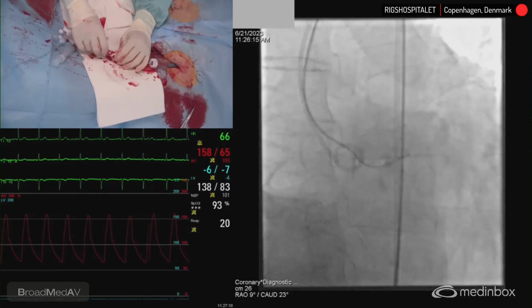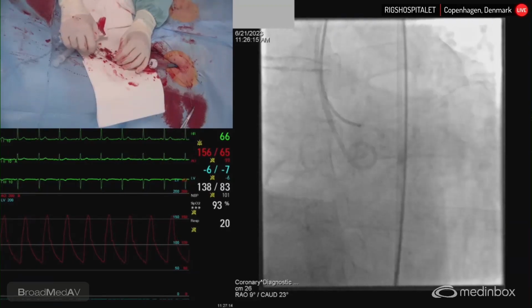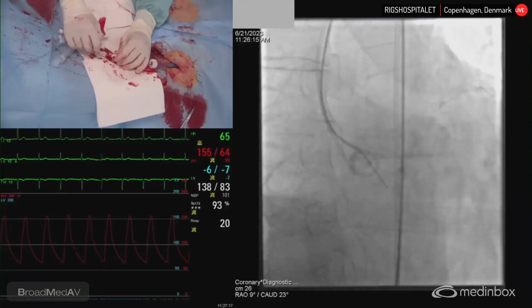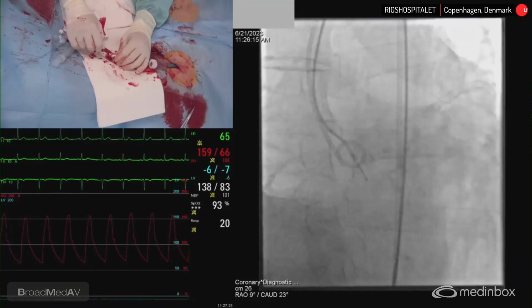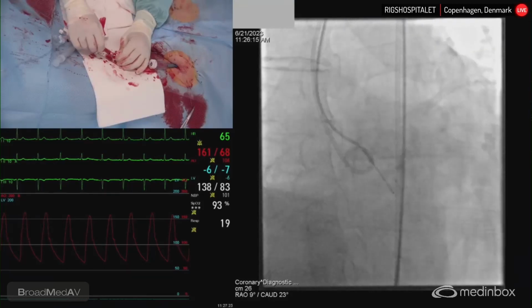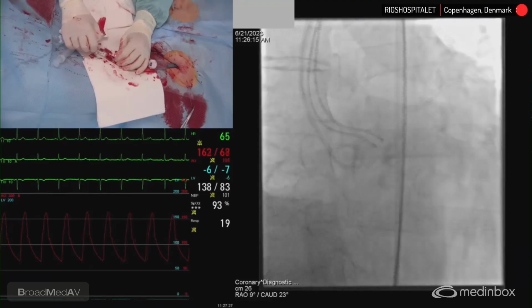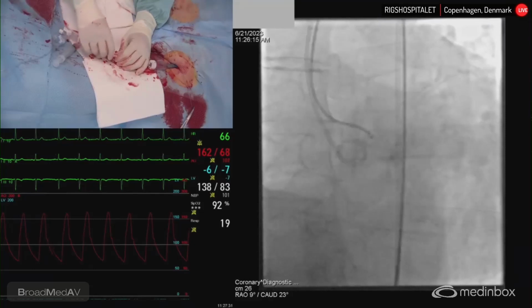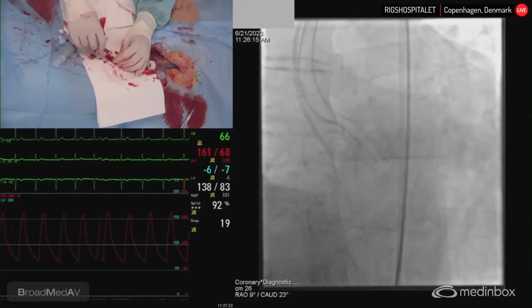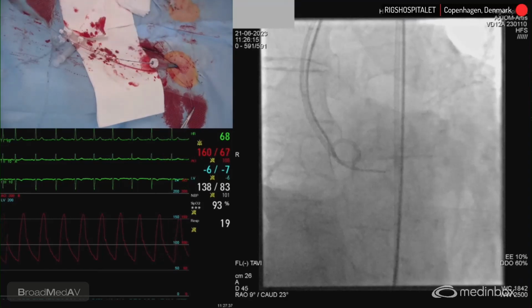It's actually a very vertical annulus, which is a bit tricky, I would say, for valve placement too. So indeed there we come too low. Sometimes even a Judkins right can be helpful, but I would still maybe like to try there, or maybe with a Terumo you can also try. I will give it a try, maybe. And then otherwise we go maybe first for a Terumo, we can do that.